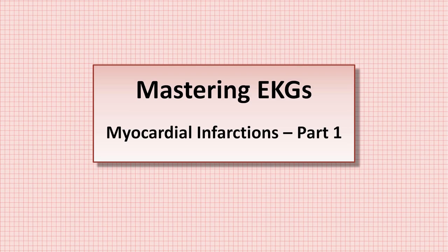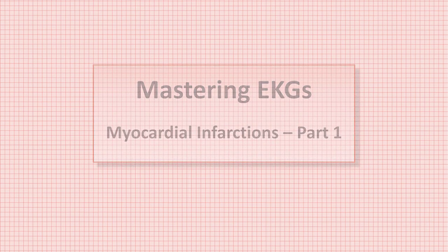This is Eric once again, and today I'll be discussing the EKG characteristics and diagnosis of myocardial infarction.